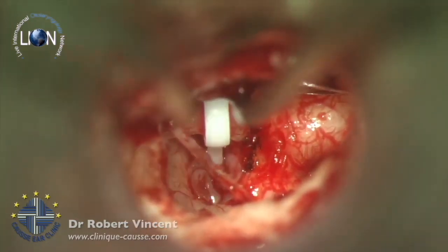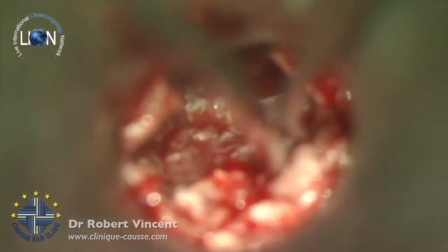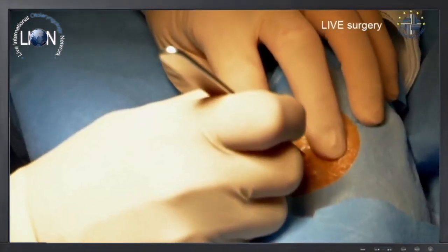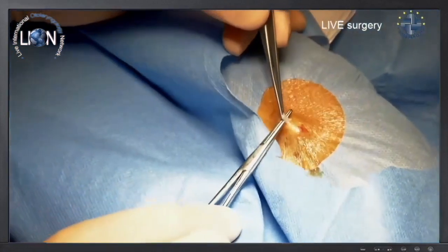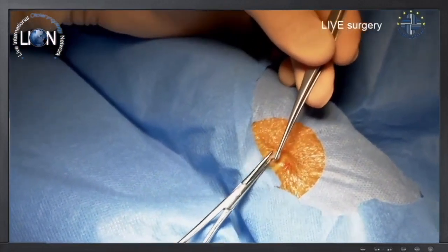The piston should bend but not move, and then checking the final mobility. So that's the basic technique I'm using. Just a few points about the vein graft now. I take the vein at the beginning of the operation from the dorsal face of the hand. Small incision, very small. So then I'm going to use only one stitch to stitch the skin.